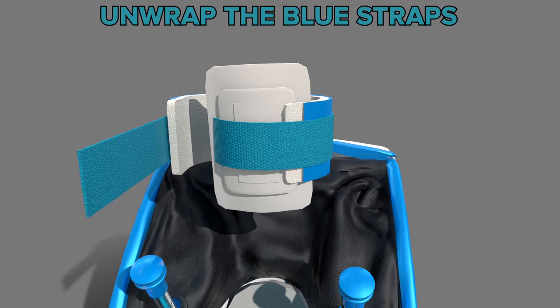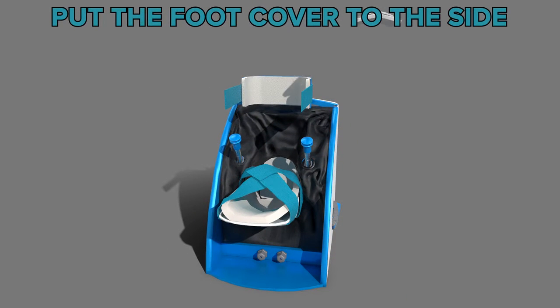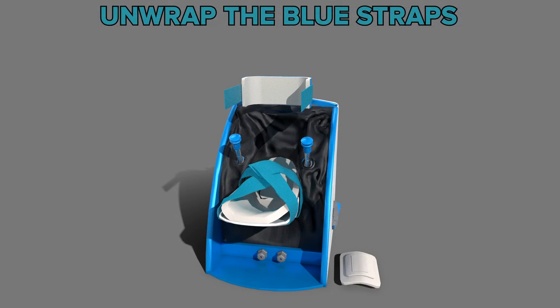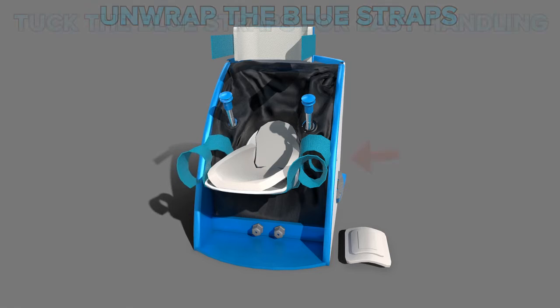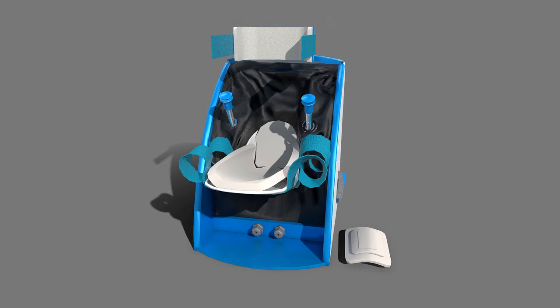The first step to putting on the foot mentor is to undo the Velcro straps at these points. Lift up the cover and place it to the side. With that done, unwrap the straps on the foot section. The blue Velcro straps may be hard to hold in place while you are inserting your foot. Tuck them under the footbed or between the chassis to make it easier to handle.